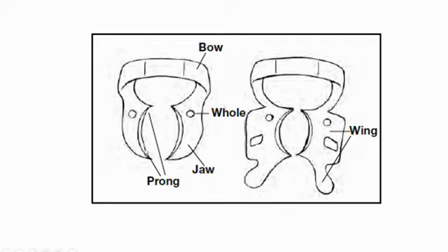See, you can see it is a smaller version and this is a bigger version. तो बेसिकली ये विंगलेस क्लैंप है. तो ये जो विंग्स होते हैं एक नॉर्मल क्लैंप्स में, जिसमें ये होंगे तो वो विंग्ड क्लैंप होगा, और जिसमें ये नहीं होंगे तो विंगलेस क्लैंप होंगे. तो दोनों के एडवांटेजेस डिसएडवांटेजेस हैं, डिपेंडिंग अपॉन आपको कैसा रिट्रैक्शन चाहिए, कौन सा टूथ आप यूज कर रहे हो. फॉर एग्जांपल जब आप मैक्सिलरी 8 या मैंडिबुलर 8 में कर रहे हो तो ये कभी कभी चीक्स पे अड़ता है. तो आई फील दिस इज वेरी इजी. इन सम केसेस वी डोंट नीड दैट वाइडर रिट्रैक्शन. तो दिस इज वेरी सिंपल टू यूज.